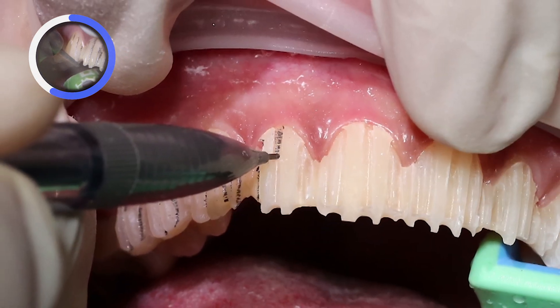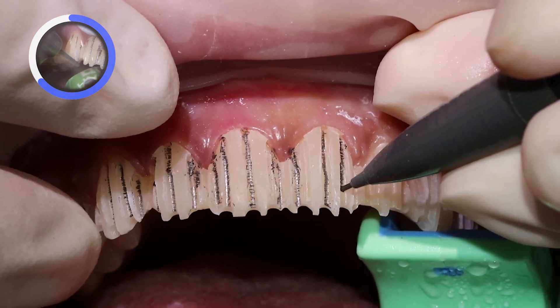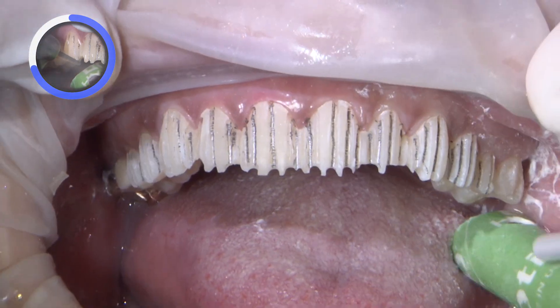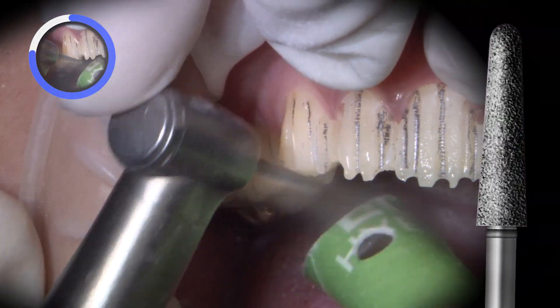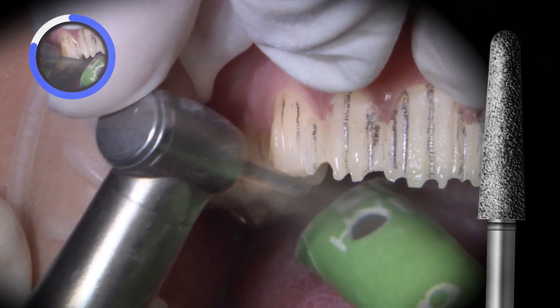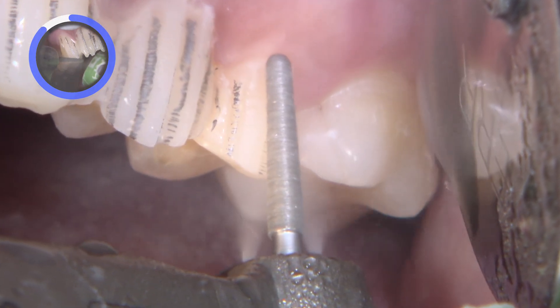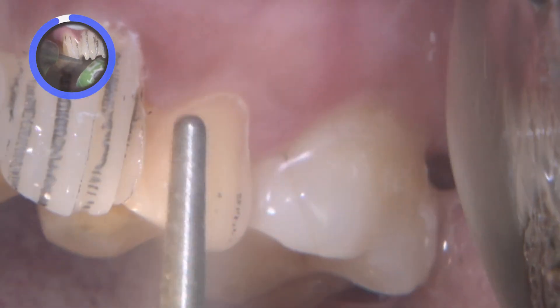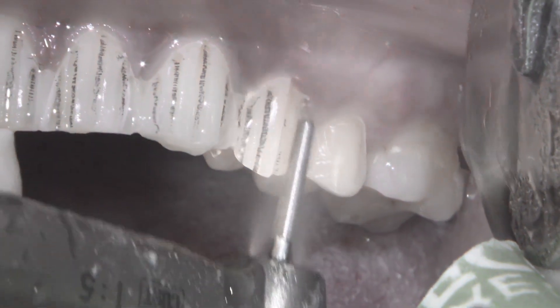The depth cuts are then marked with a lead pencil so I have an easier time identifying when I've blended the unprepped areas down to the ideal depth. Once the depth cuts have been marked, I switch to a larger 850-018 burr to expedite the finishing of the preparations. Now it's just a matter of ensuring the finger projections at the incisal edges and the facial surfaces have blended together through the depth cuts, resulting in a smooth and continuous surface throughout the preparation.